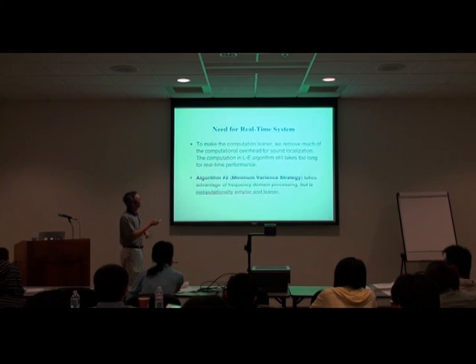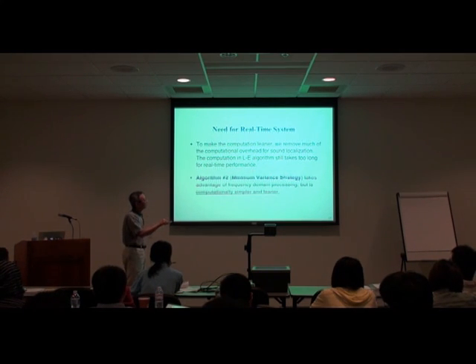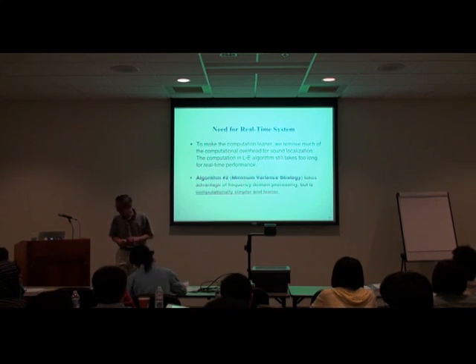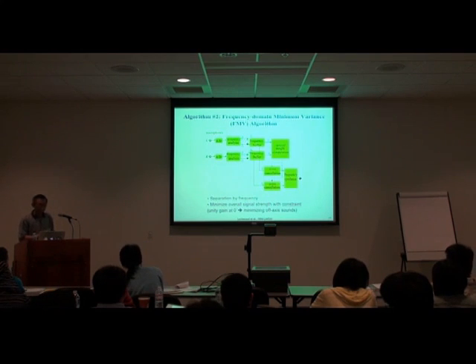So we decided that we couldn't do the real-time processing using the localization extraction algorithm. It just takes too long, a few 100 milliseconds, which is way too long for processing in hearing devices. We can limit it to about 10 milliseconds or less. So we then developed this minimum variance strategy. It takes advantage of its computational efficiency.